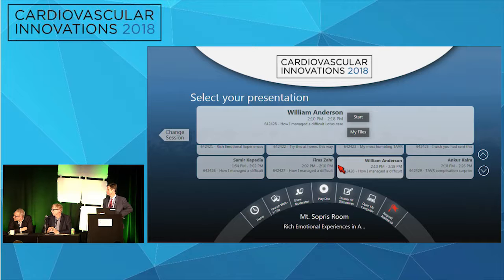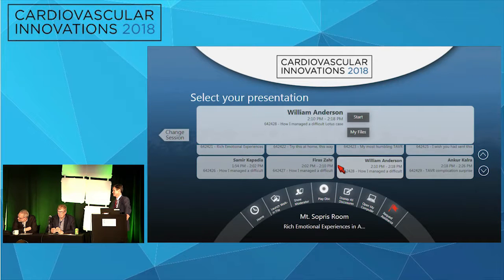I was going to bring my case, which was very similar, where we IVISed it, we protected it, we left. We thought that the leaflet was fairly away from it, a little bit. And so we left it. And while in the cath lab, she dropped the pressure, ST segments, and we stented it, and she did fine.